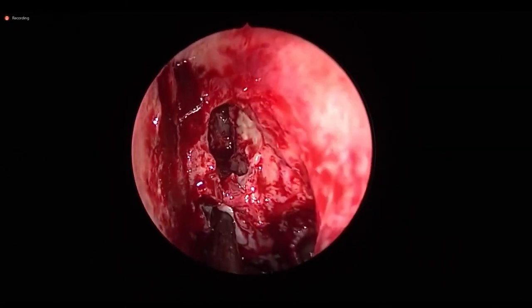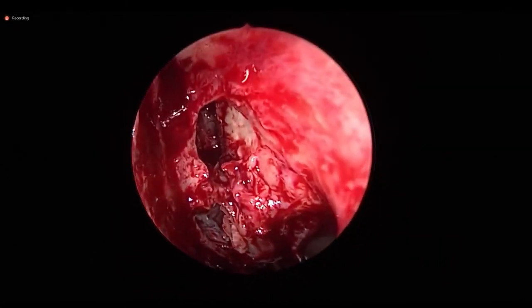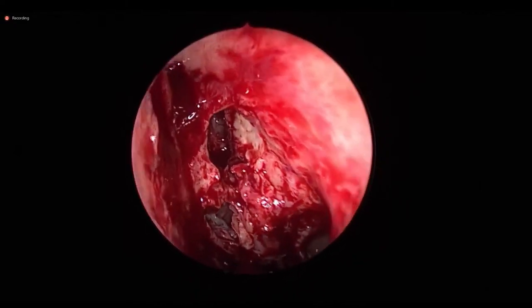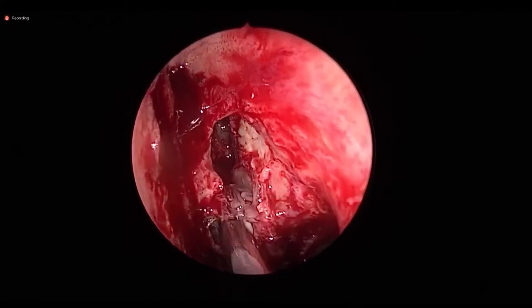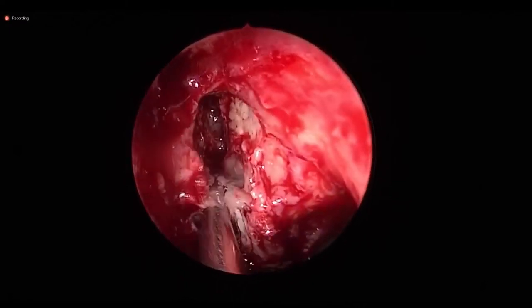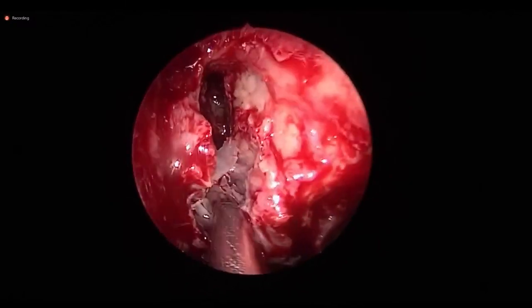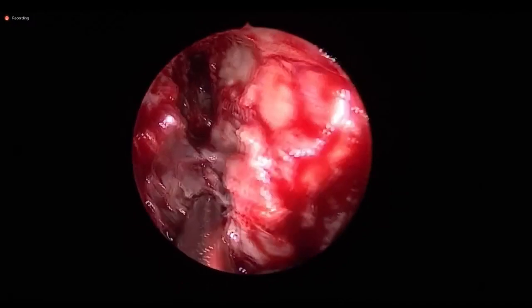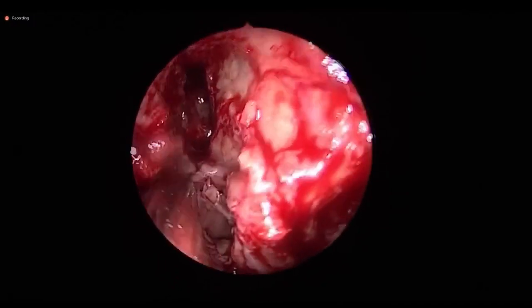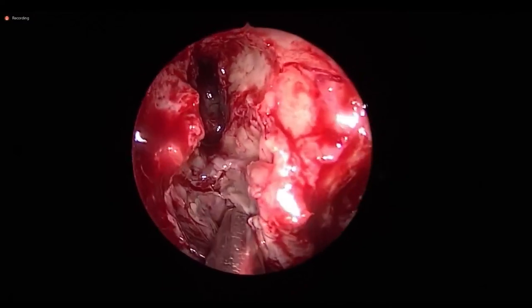We have the 70 scope, but I'm talking about this debrider wand angle. If you have a debrider, why don't you have the 120 blade also? They have not provided. Yes, you can have. This is really useful for frontal. But if it's not there, then what other instrument can we use? All angled instruments, but they make your life so difficult.